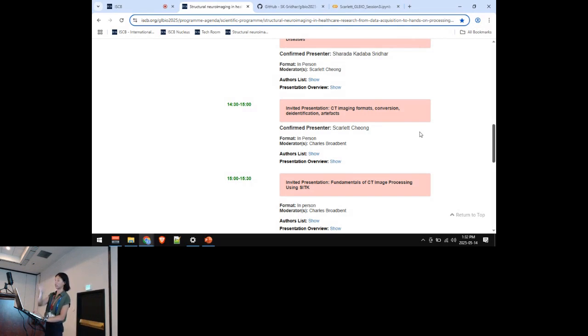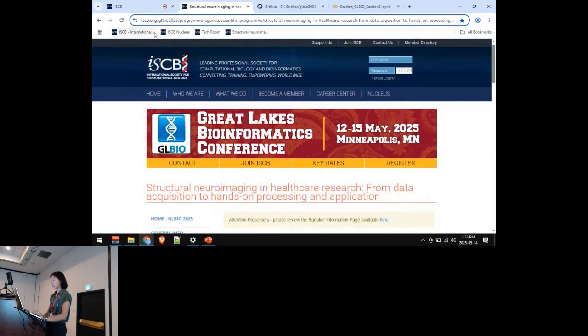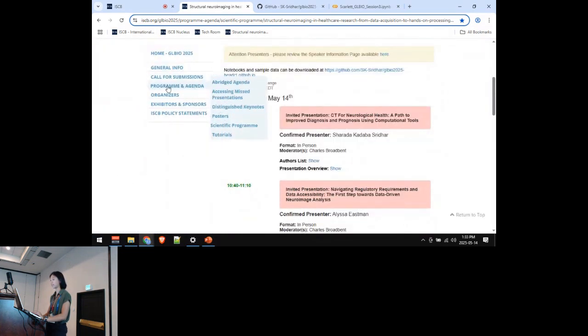So, like Sharada just said, this will be a hands-on activity. If any of you are interested, you can go to the ISCB website and then go to the agenda tab, program and agenda right here. And then you should see on Wednesday, May 14, a GitHub link. I can give a couple minutes to set up.